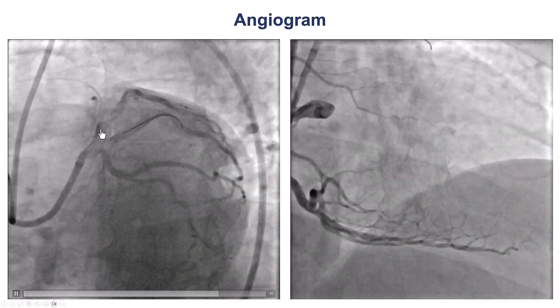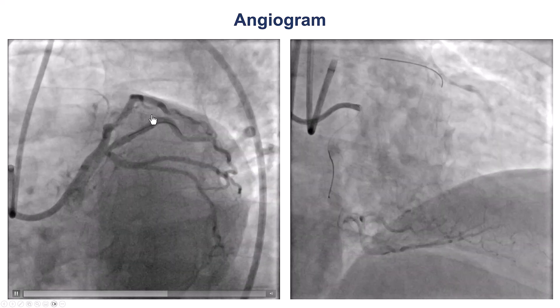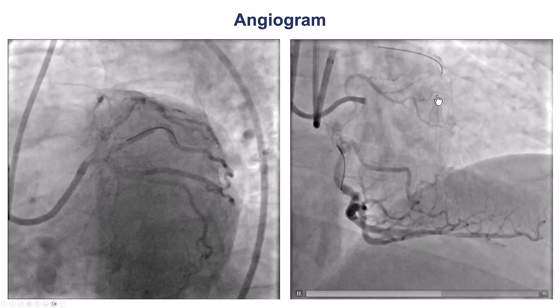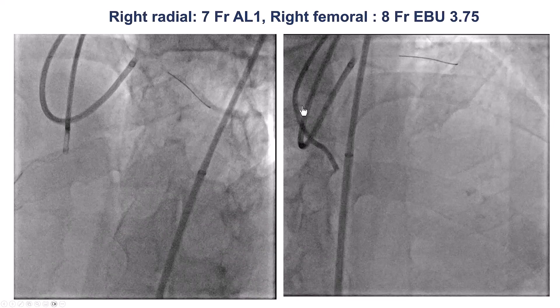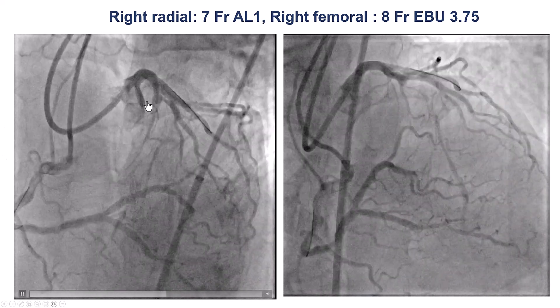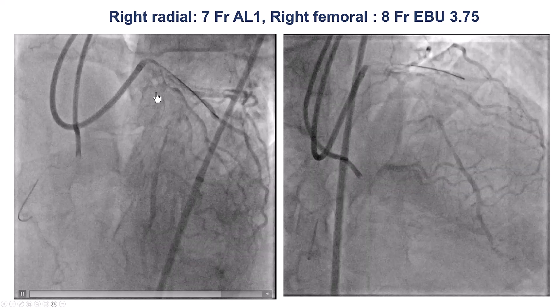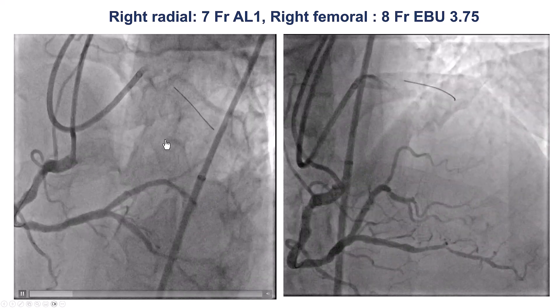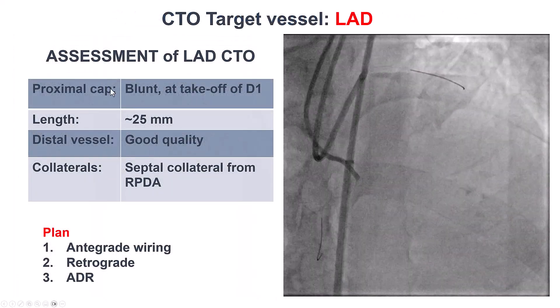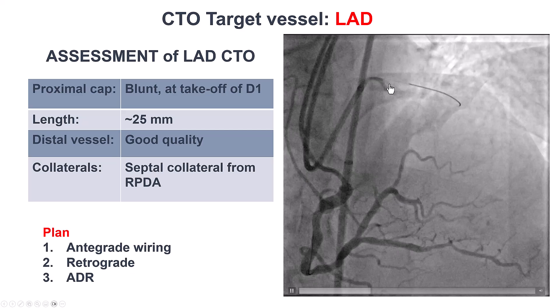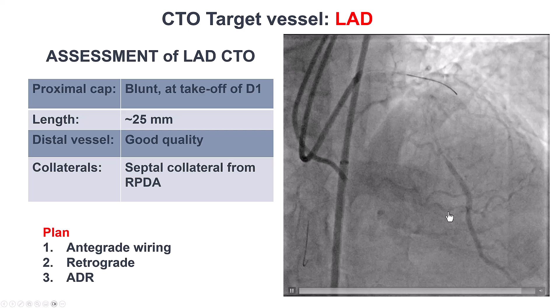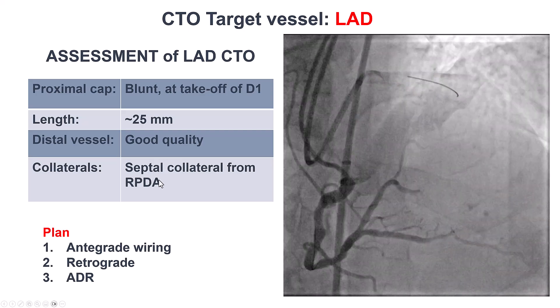The LAD was occluded right after the takeoff of a large diagonal branch. It had a blunt proximal cap, and there were some septal collaterals filling the mid and distal LAD. These are different views obtained with femoral and radial access. Again, we have a blunt but well-defined proximal cap, then the occlusion, and some diffuse disease into the mid LAD. We have a length of about 25 mm, good quality distal vessel, and septal collaterals from the PDA.